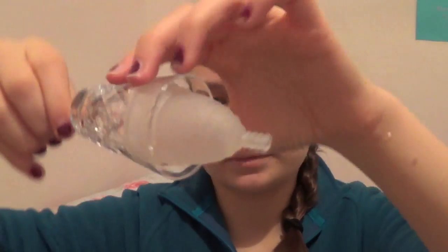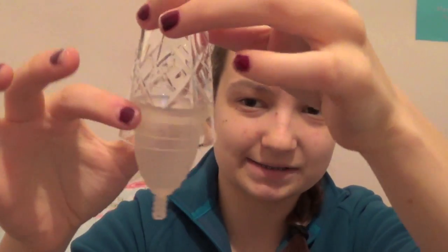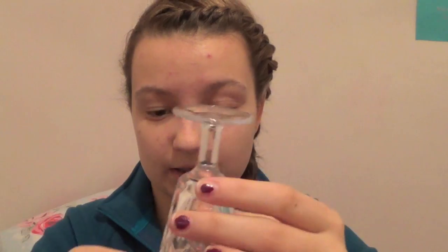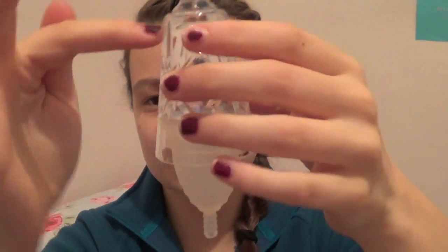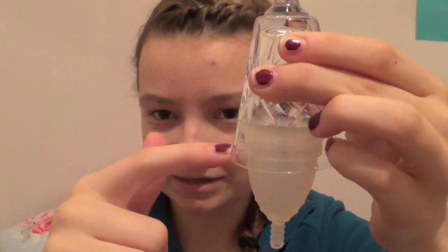There we go. Now, as I said before, it doesn't matter if it's at a slight angle, it should still work. But you've got to imagine that the vaginal wall is coming right down to here, so it extends way beyond this. Now, your cervix is the kind of entrance to your uterus, so to speak. From your vaginal canal, you have your cervix and then your uterus. So if your cervix decides to drop, as is very common when you get your period, actually mine does it, what can happen is you insert it next to your cervix. It can embed itself into the wall of your vagina, which is very annoying.